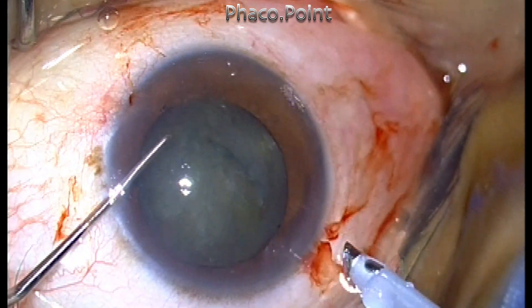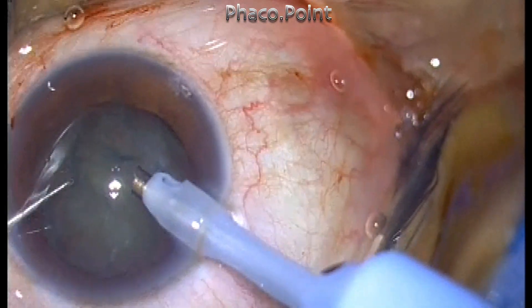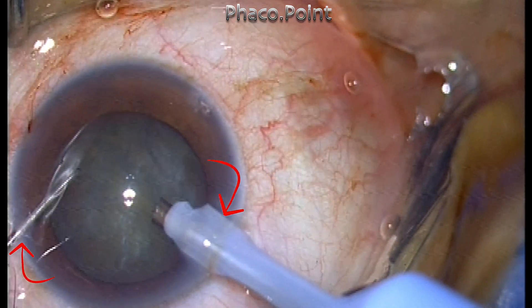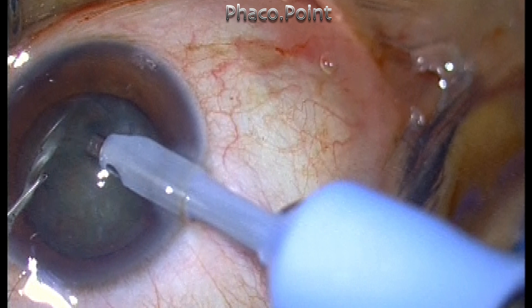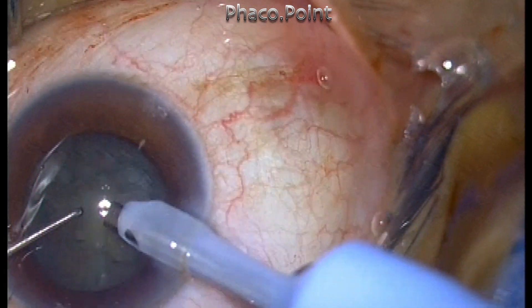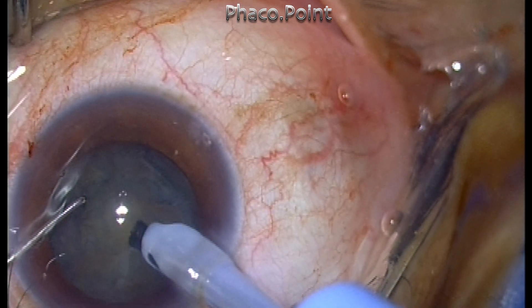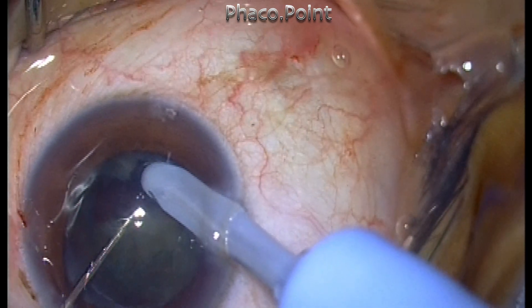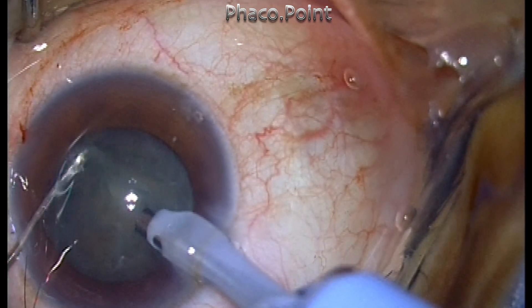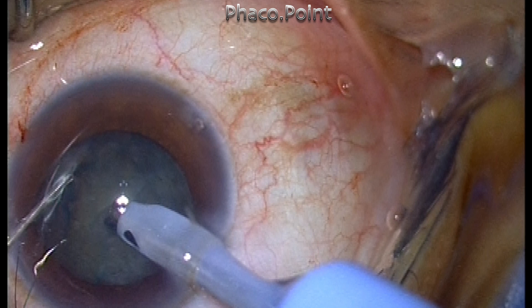Even as I started with phacoemulsification, I noted that the separation between the main incision and the side port incision was more than 120 degrees, which meant that the side port was actually a dummy. It was not really performing its function, as the vector and the fulcrum of the side port was such that it was quite ineffective in either creating the chop or acting as a useful tool.